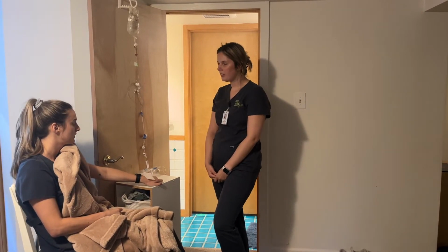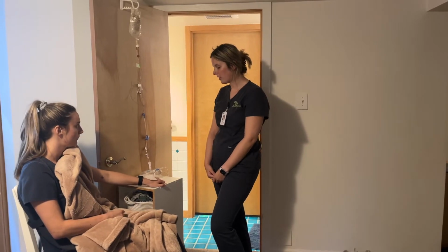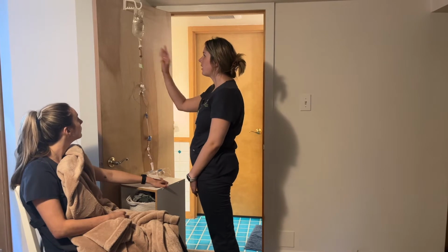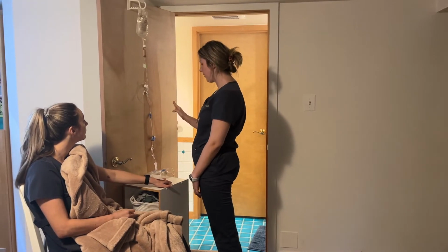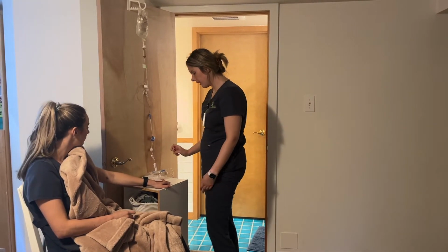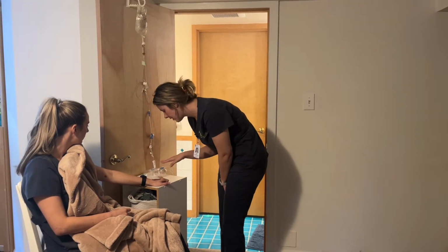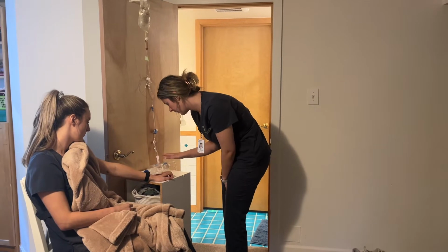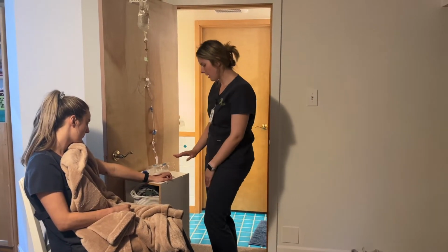Do you have any allergies? No. Okay, I'm just going to take a look at your IV and your IV bag. So we have normal saline running at 30 mils an hour to keep the vein open. Looks good, no kinks. Just going to check your site. Do you have any pain here? No. Okay, it's free from redness and swelling, and it looks patent, and everything is running.